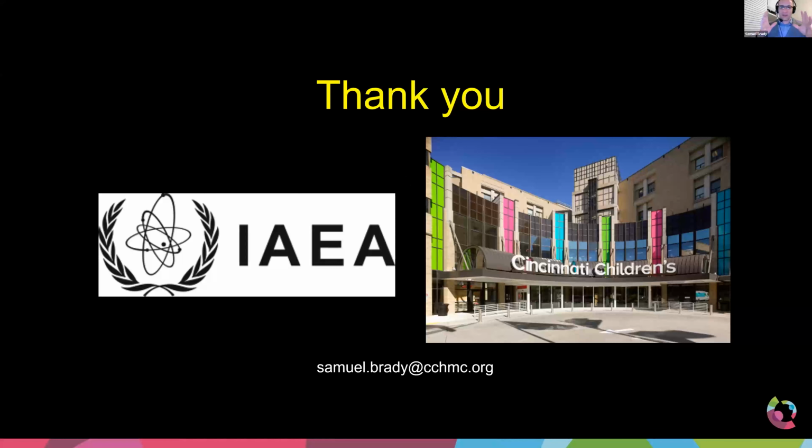And so it's still best to keep the body nice and centered. So centered up and down, left and right. And from that, then you can go in and you can set your field of view. You might actually only set your field of view around the heart, or you might set your field of view even thinner around the spine. But always keep the body itself centered.